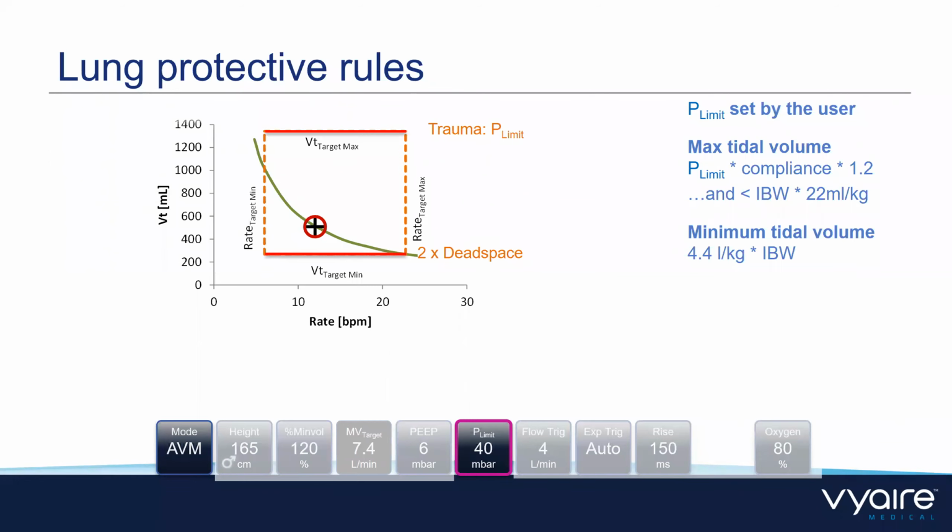So whatever happens, the inspiratory pressure will be increasing or the pressure support will be increasing to keep the patient above 270 ml. So dead space ventilation is not possible. On the timing base, we prevent auto-PEEP by determining the expiratory time constant. That means that the expiratory time constant is your limiter and telling the ventilator how much time the patient needs to exhale. And this is the time AVM will give the patient. So it's not possible to develop and build up auto-PEEP.